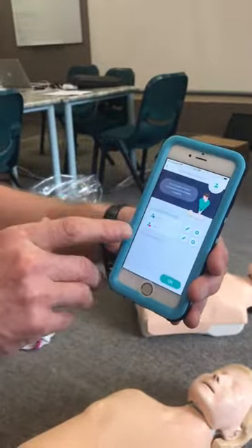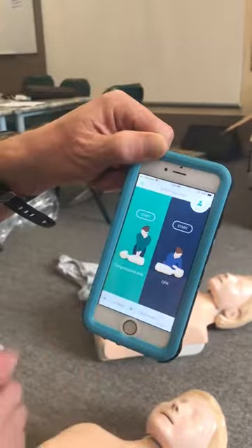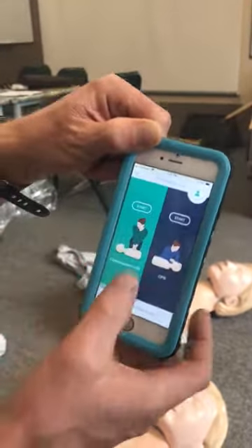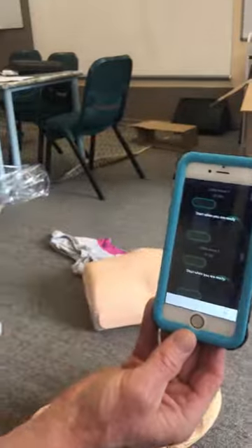We've got a total of four mannequins so we can have more if we want to. Basically, as soon as you power the mannequin up, this app will get you to connect with the mannequin and you'll be away — pretty self-explanatory. Once you're hooked up, you have an option of doing a compression-only minute or more, or compressions and breaths. So if I go to compression only and push start, the time's going to start when I start pushing. I can see I've got little Annie one and little Annie two in here, so when someone starts pushing on those mannequins, something's going to happen on the screen.